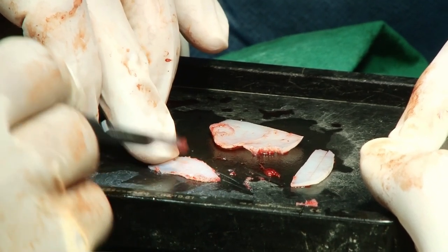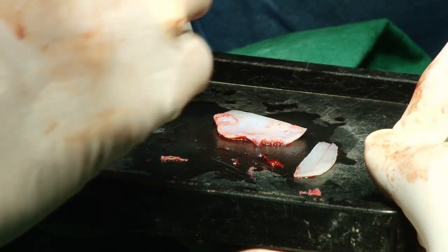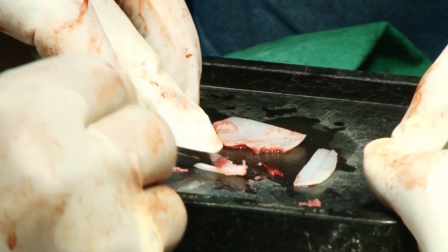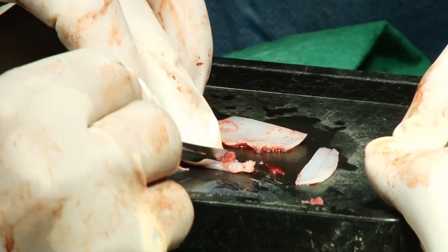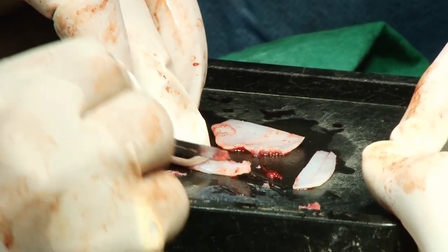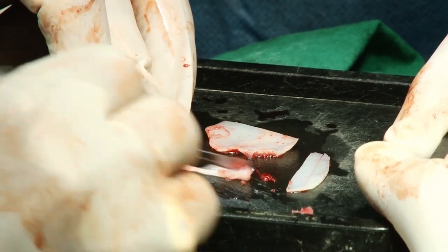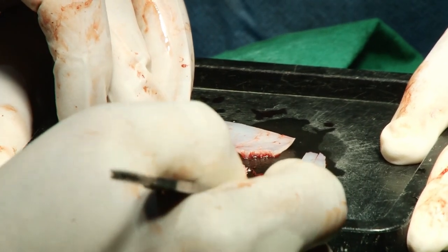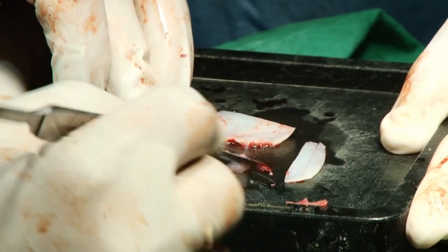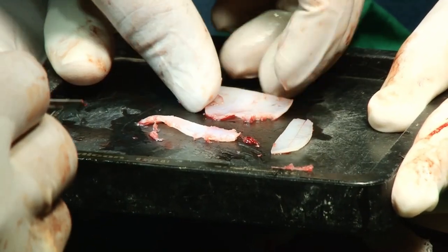This patient basically needs a strong reconstruction of the main culprit, the anterior part of the septum. For reconstruction of the anterior part of the septum, I have a different way. It depends on the individual approach of the surgeon, but you need to reconstruct it very well and properly.